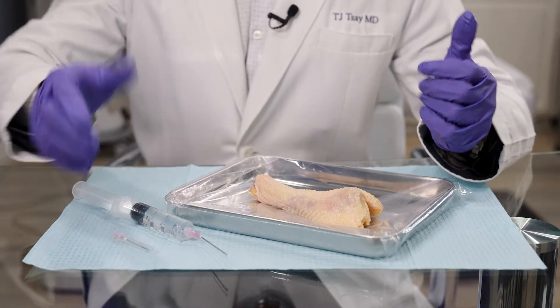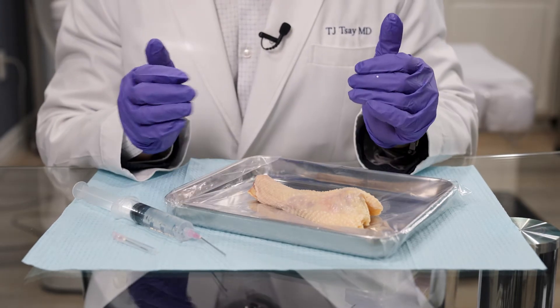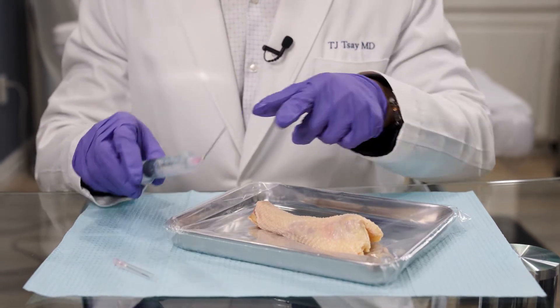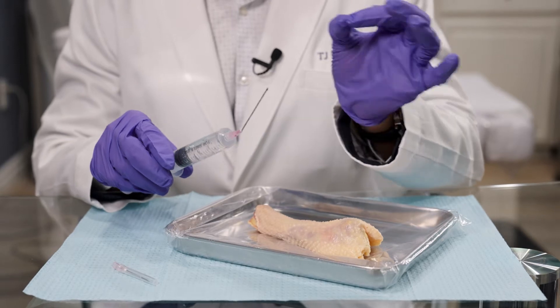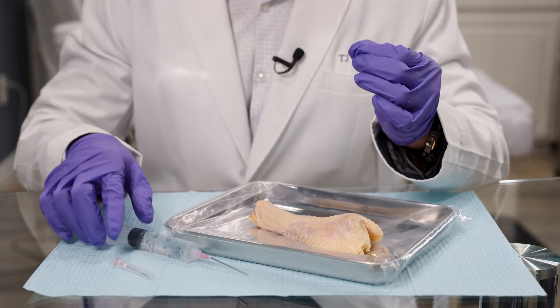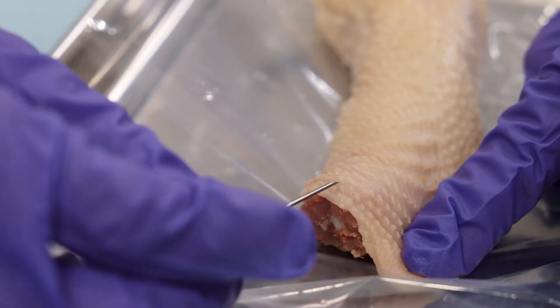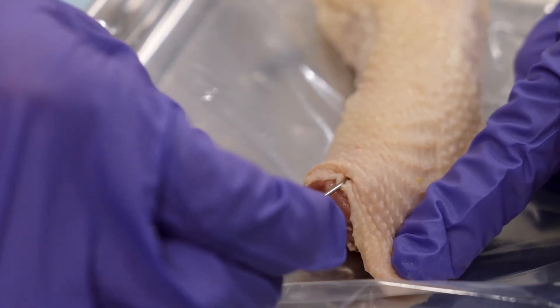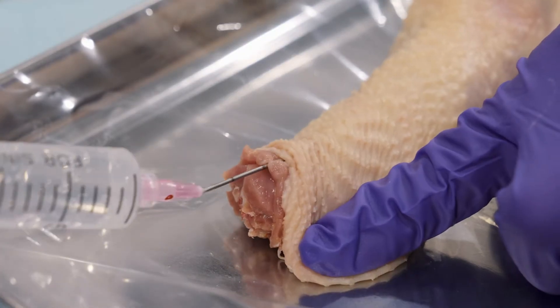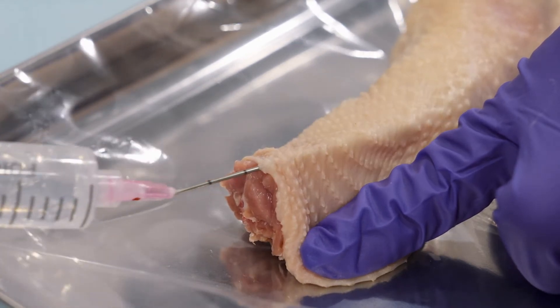Remember, the patient has been prepped and cleaned with iodine, and the entire area has been anesthetized with a nerve block — the patient isn't feeling a thing. I use a blunt cannula; it looks like a needle but the tip is blunt and rounded — it doesn't pierce anything. To access the organ I do need to make a small incision or poke hole using an 18-gauge needle, and then I'm able to access underneath the skin with the cannula through that porthole.